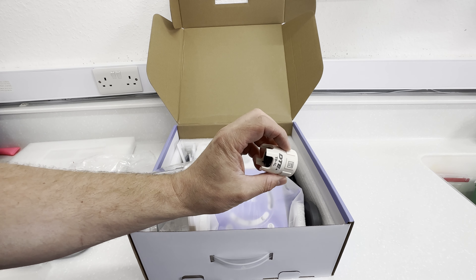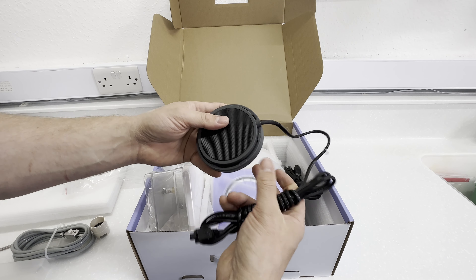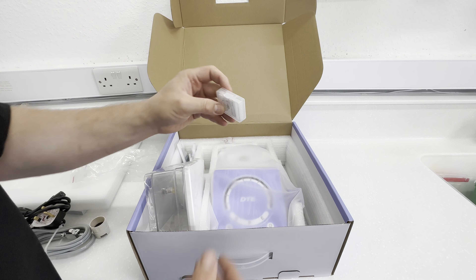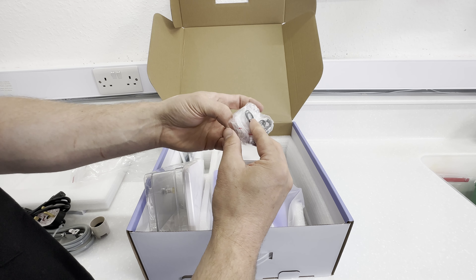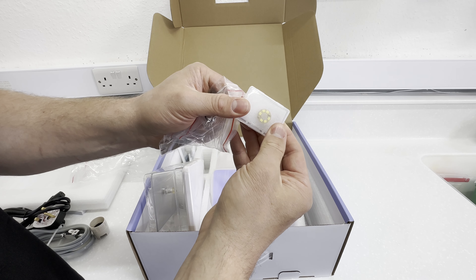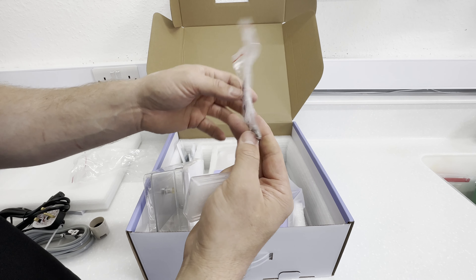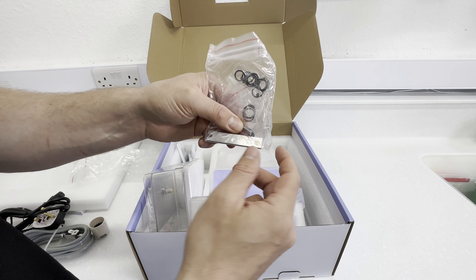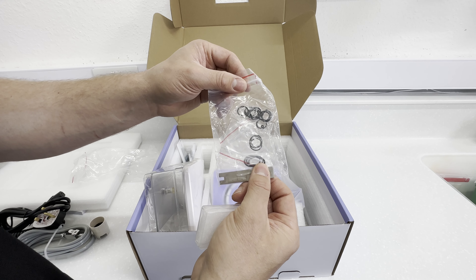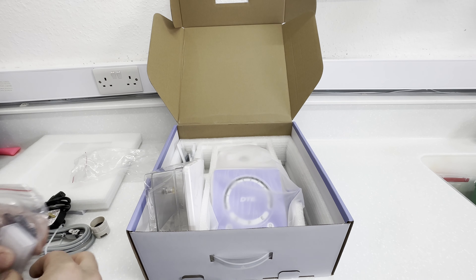We've got the tightener — we've got about 50,000 of these in the practice. We've got the foot pedal and the power cable. And then we've got what looks like a maintenance pack — this is brilliant. There's an extra spare light for the ultrasonic unit, O-rings, and I'm assuming this is the tightener for the tips. I love this — it's kind of future-proofing the unit itself.